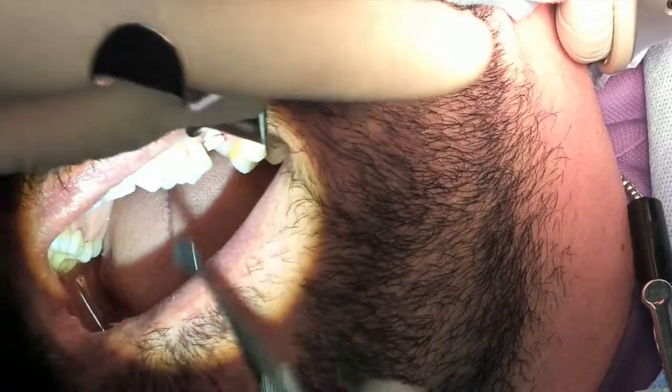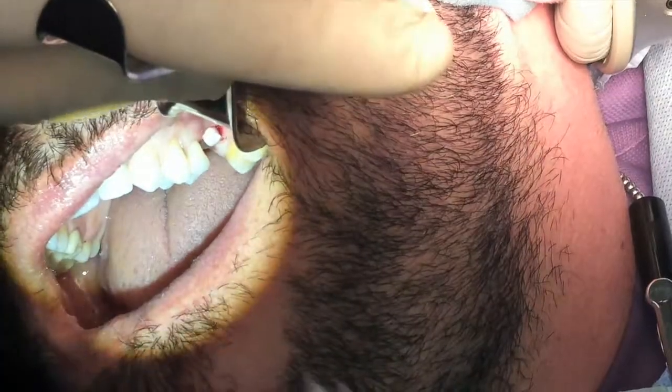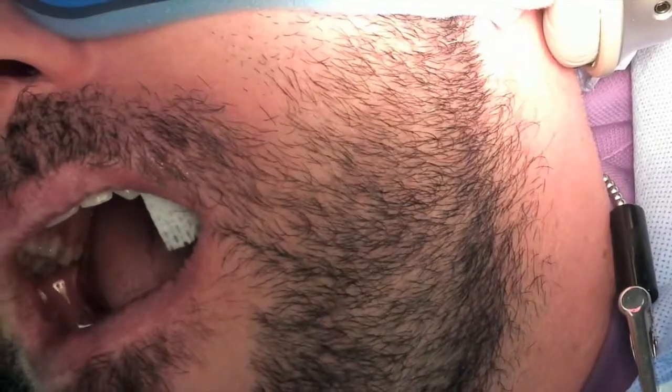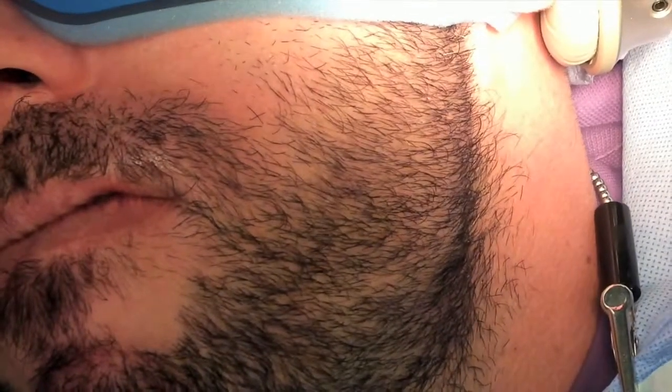All right, so we're just going to... Now what we're going to do is one more thing. Okay, so your implant's everything's done. I'm just going to do a little graft to the outside to build the plump up, okay? But you're doing great. Implant's all done. You did it with the mallet.